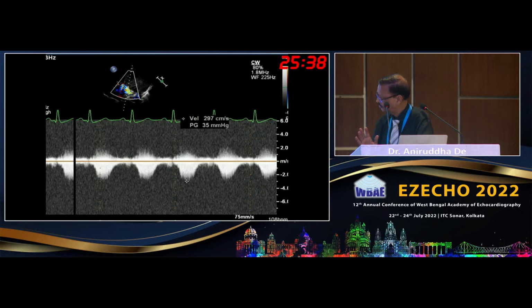The areas of echolucency, if I consider them as necrotic areas, and these are not vascular spaces, then I have to believe that some kind of tissue apoptosis and necrosis is going on, so this probably is a malignant mass. It's not vascular. We put the color, though this slide is not there. But one thing is that the Sonoview is going to help, Dr. Nitin, in the extracardiac mass.